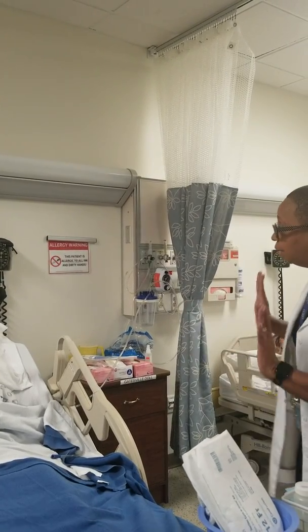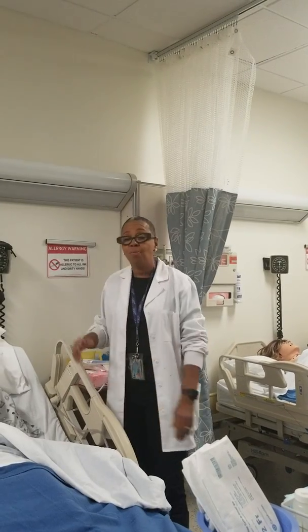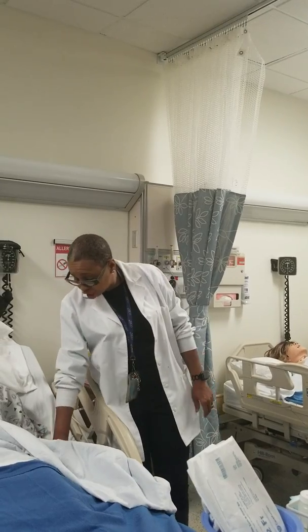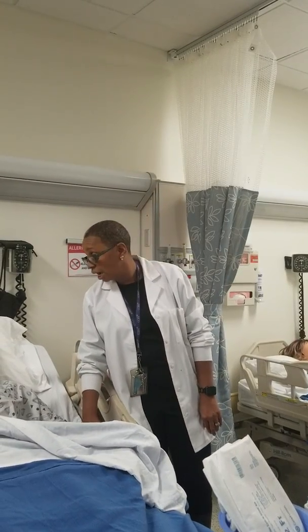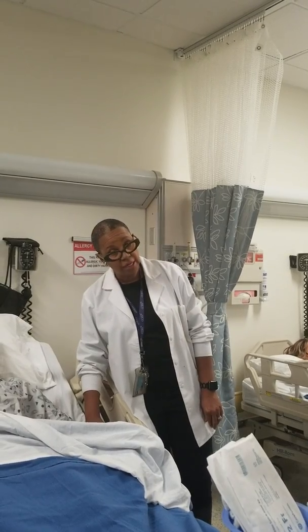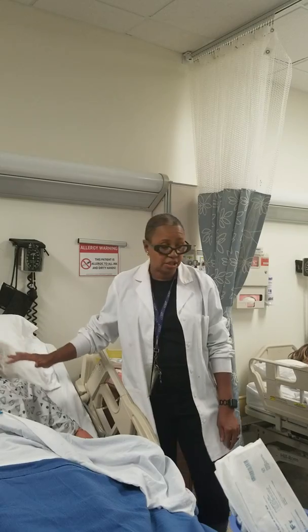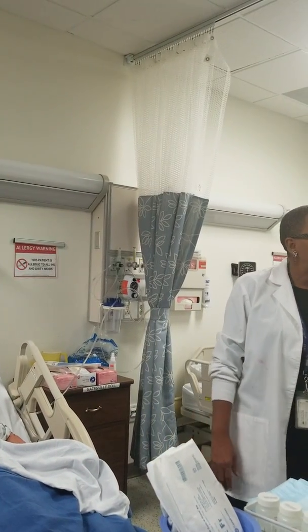So I come in, I go, hi, Mr. Jones. Can you tell me your name? Date of birth. He won't be able to talk to you, okay? If he's conscious, he'll nod. You know, are you Mr. Jones? So that's why I have to check his wristband, okay? I have to identify the patient with two patient identifiers. If he has a cuff trach, he should not be able to talk to you. But that doesn't mean he's not conscious enough to nod his head, right?